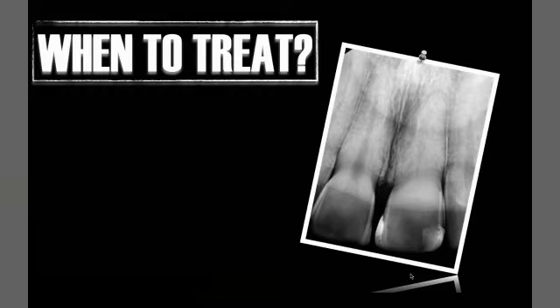Okay, go straight. Okay, now the question is when to treat calcified teeth. You can see on this X-ray upper two central. You can see the difference in the size of the pulp chamber, and on the left central we have calcified pulp chamber and a little bit narrow canal. So this X-ray belongs to me. This is my tooth. I had a trauma maybe 15 or 20 years ago. I fell on my bicycle, and I had trauma on my central.